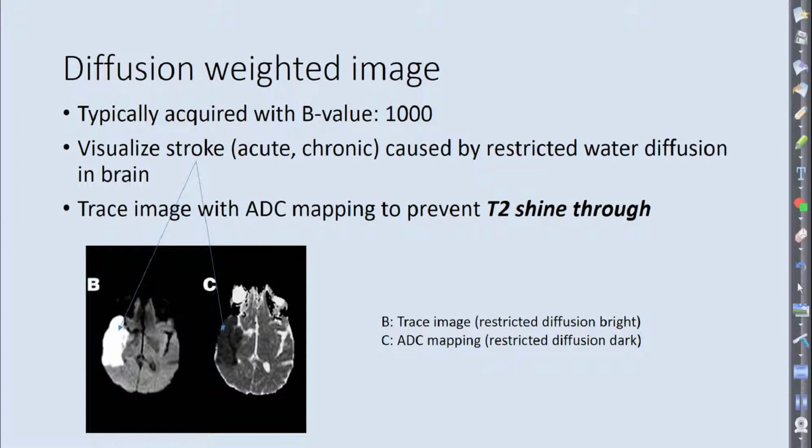Which one do you find easier? Studying more about the brain or about how the physics and everything works? Procedures is easier. Yeah, but I also think that they're kind of dependent on each other. They are, and that's what I wanted to show you guys. It's not only just setting up the slices, it's knowing what these sequences are looking for. Exactly, yeah.